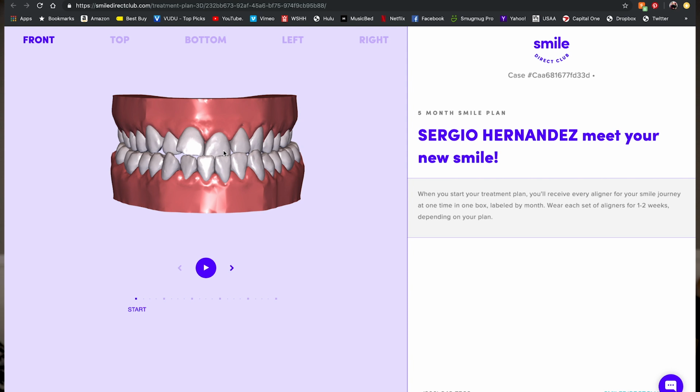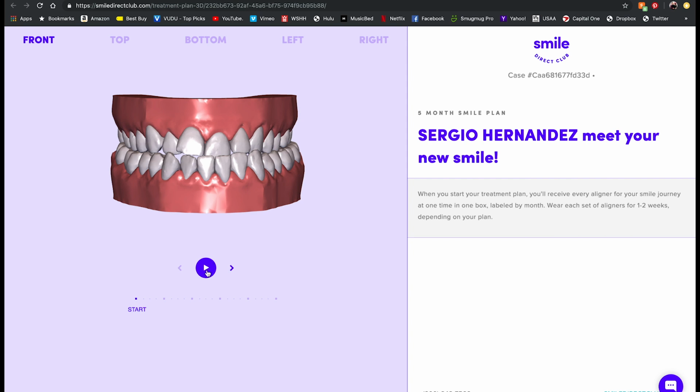So this is basically my teeth right here. You'll see that this one is kind of lower, and this one's a little bit more pushed up. And this right here is basically the most of my insecurities, because I've noticed that every single time I talk, especially after starting my YouTube channel, I can see that tooth basically showing. Let me push play for you guys so you can see. If I push play right here, it's going to be month 1, 2, 3, 4, and 5. That's supposed to be the final results for my mouth right there.